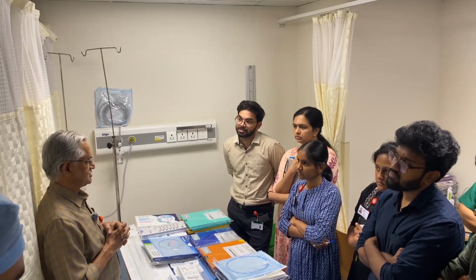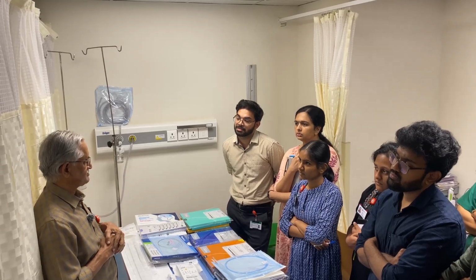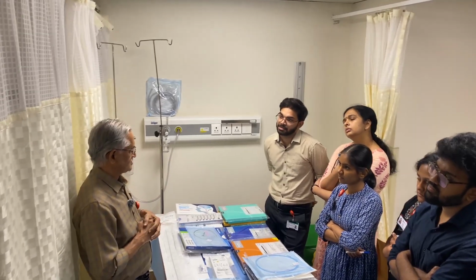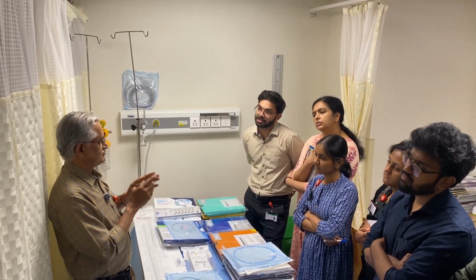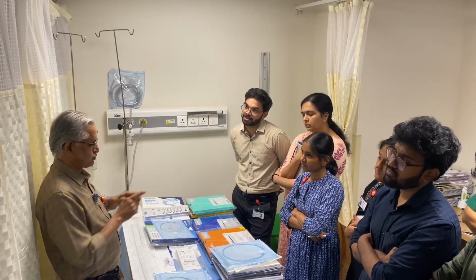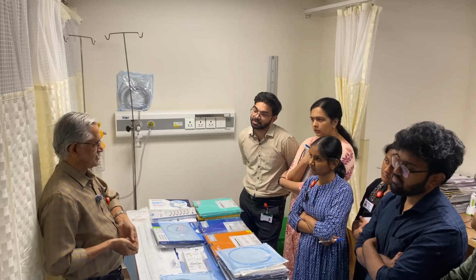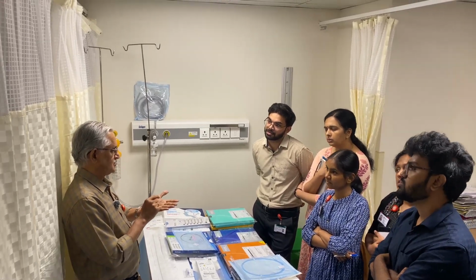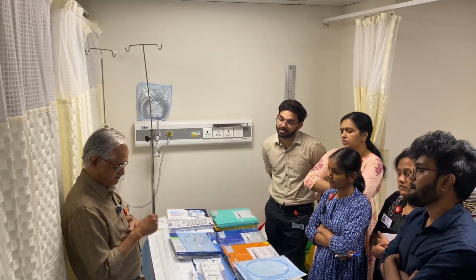Second one is the acute stroke situation. When you see a proximal middle cerebral or ICA occlusion, you pass a catheter there and then try to aspirate the clot or dilate and put a stent retriever. You cross the lesion and the clot, an acute, soft clot, and we are trying to take it out. You pass the clot with a microcatheter and through the microcatheter you put a stent retriever.